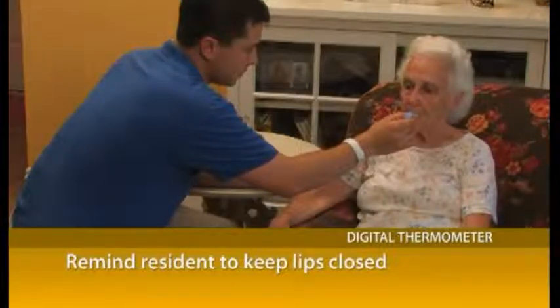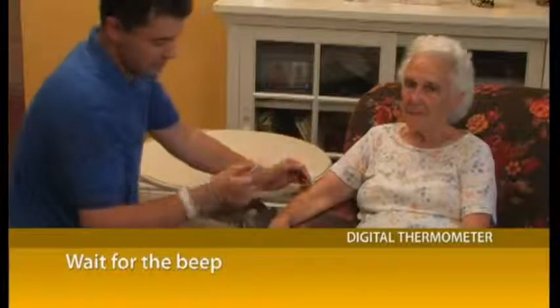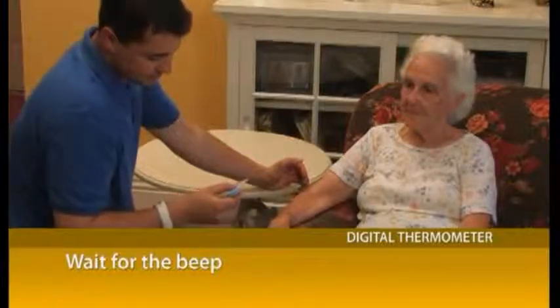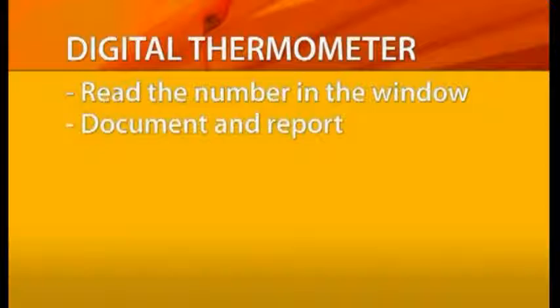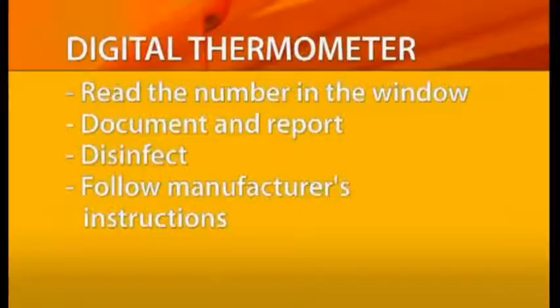Keep the thermometer under the tongue until the digital thermometer beeps. Remove the thermometer when the number shows up in the window. Read the numbers in the window and document. Remove or eject away the throwaway cover. Disinfect using proper protocol. Place the thermometer back in its holder. Remember to always follow manufacturer's instructions.